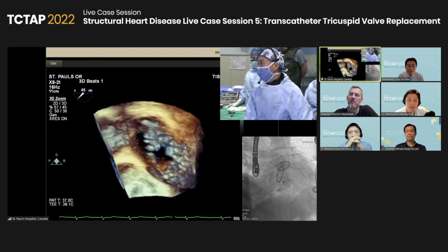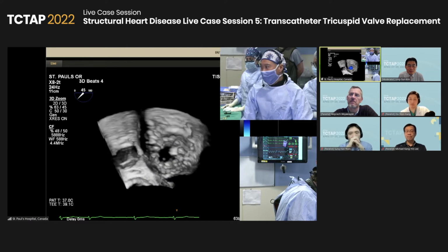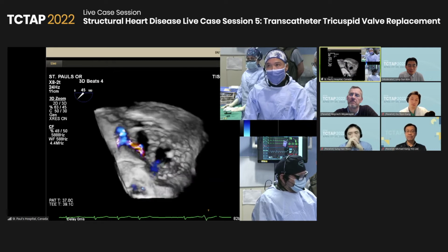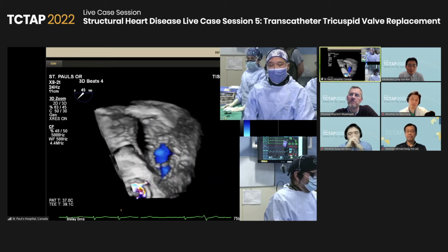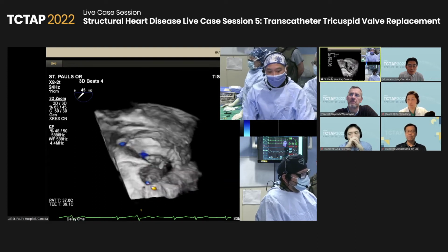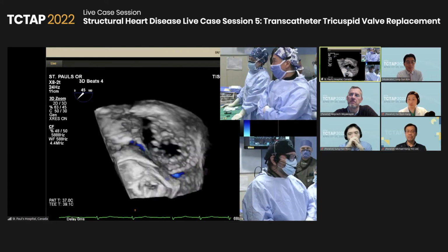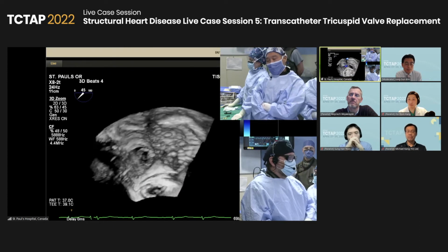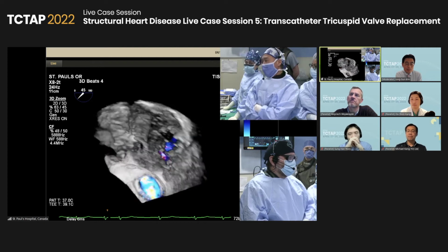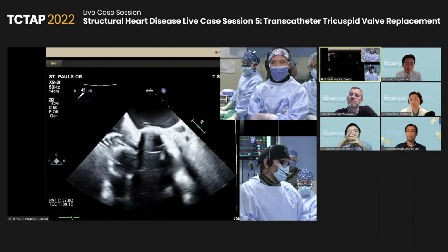So far, for this particular device, you remember that we screen patients for all devices, including surgery. If they are not candidates for a commercially available option like clipping, then we assess for investigational devices, of which we have 3. We like to explore them because we don't know which one is the best so far. This field is quite early on. We screen them and look at the best device. In this particular device, the screening failure rate is very low.